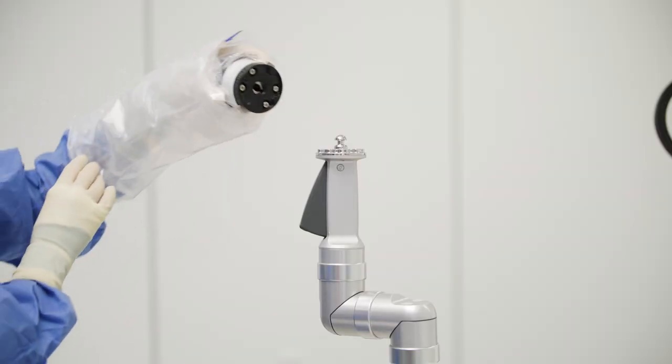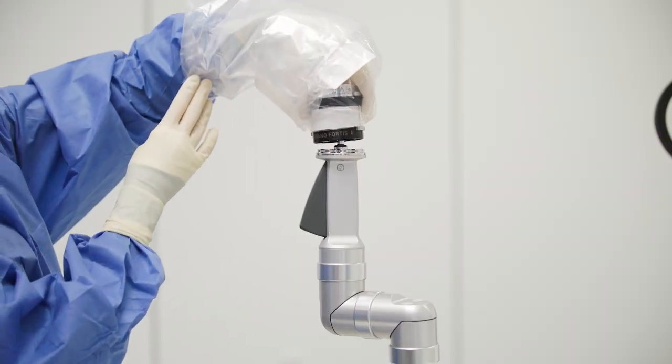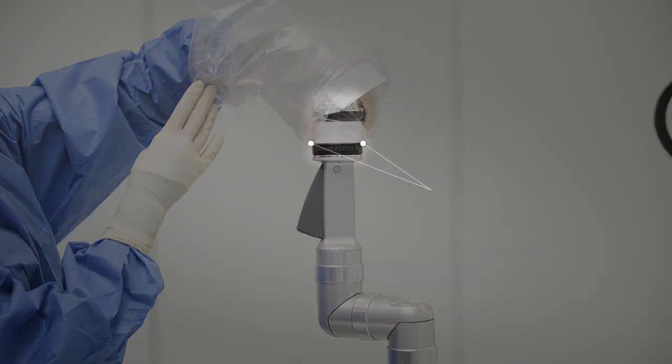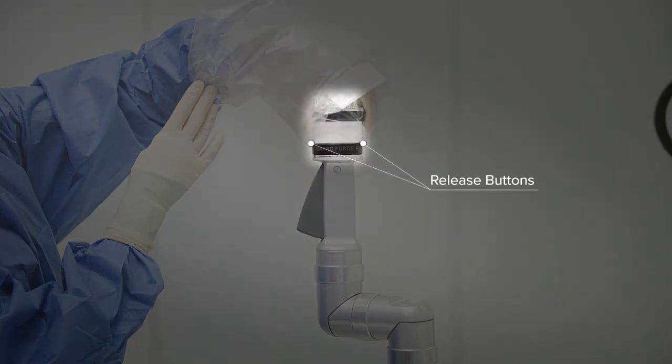Fit the adapter in the direction of the arrow to the pin of the support arm and turn. The locking device engages with an audible click. Both release buttons should protrude when the adapter is fully engaged.